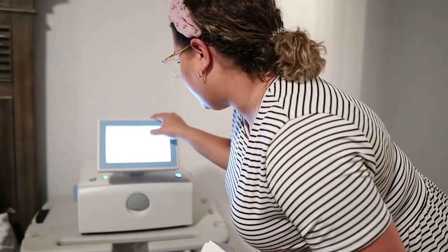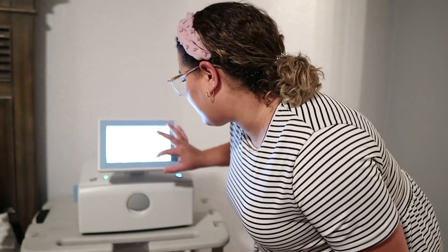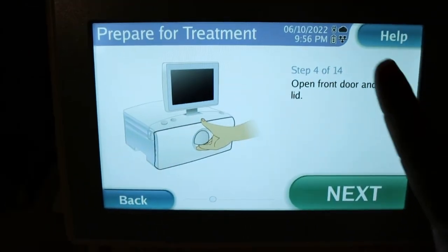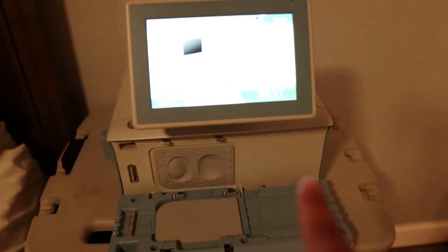Blood pressures are also really important — he takes it twice a day, and this information goes back to his dialysis nurses. Temperature is also taken to make sure he's not getting an infection. They're able to look at his weight, his blood pressures, and measure trends over time to make sure everything is going okay. The machine screens literally show you a picture of what to do, so if you're intimidated by home dialysis, it walks you through it.